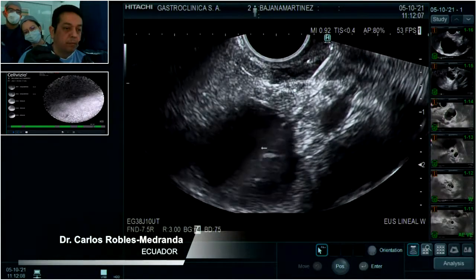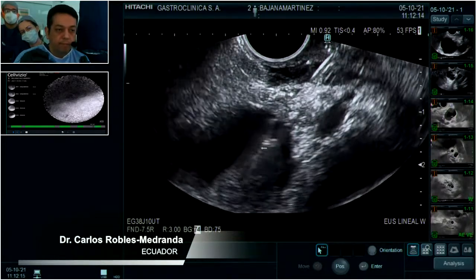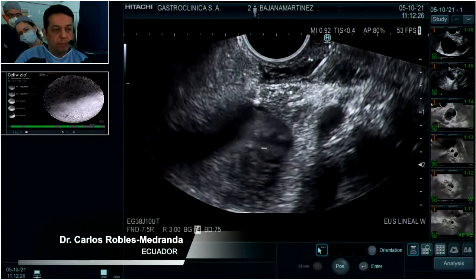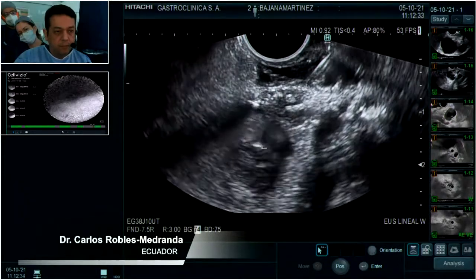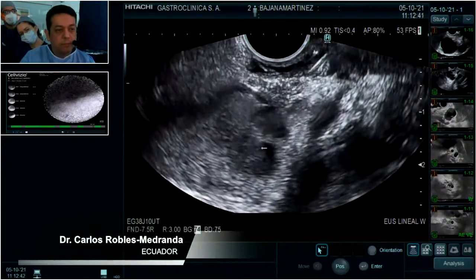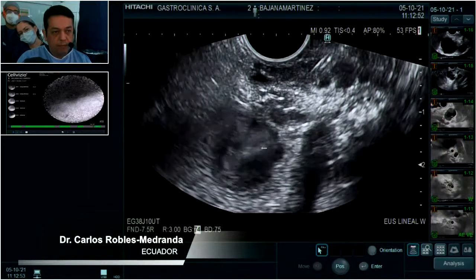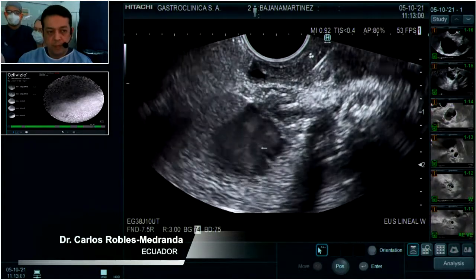Okay, now I have tissue. And I will do an aspiration now.